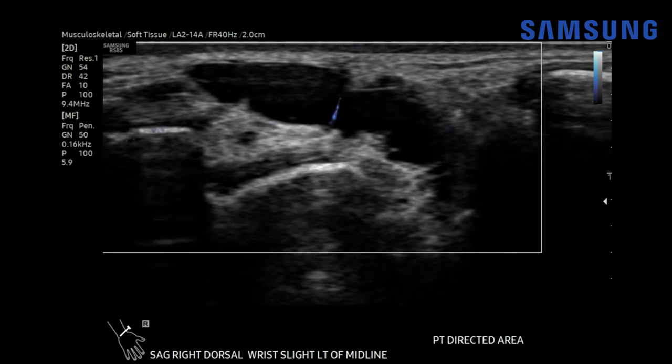Here we're adding microvascular flow, which can detect slow flow in small caliber vessels. We see some diminutive septal flow within this structure, but no real solid mass-like flow. It appears primarily cystic.